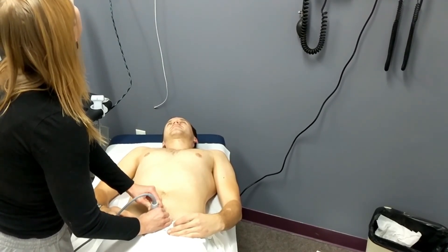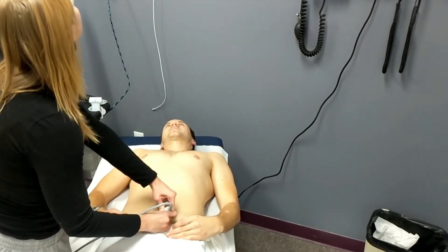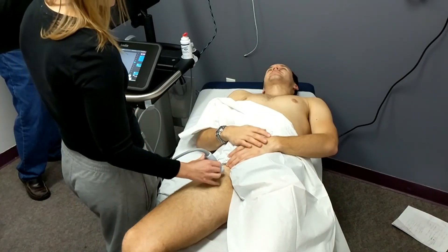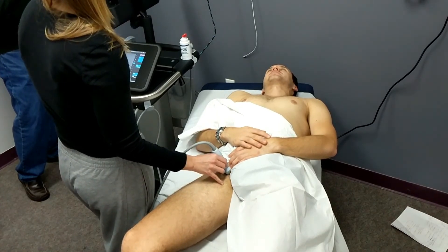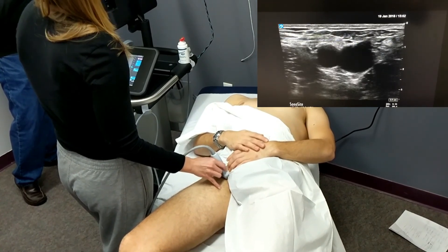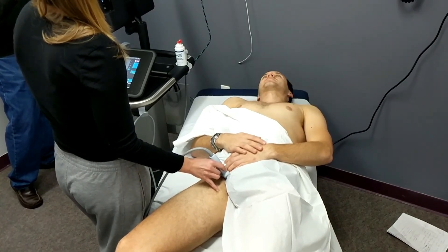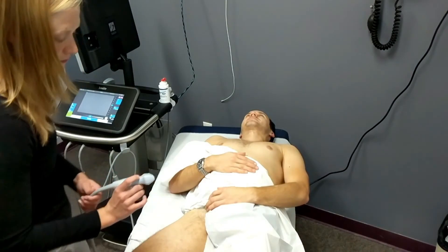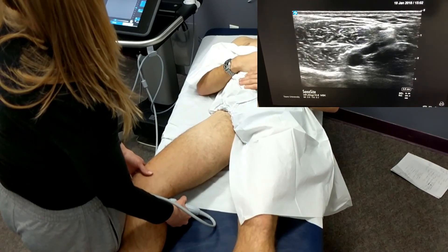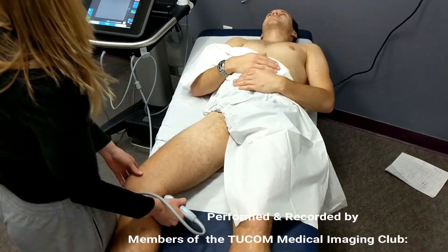Then our student will change transducers from the phased array to the linear array, using it to evaluate for deep vein thrombosis. She starts with the femoral vein, locating where the common femoral vein and artery are, then puts enough pressure to collapse the vein fully — getting the nice wink-back sign that shows the vein is intact. She then moves to the popliteal area, examining the popliteal artery and vein and once again applying pressure to see that vein collapse and wink back.